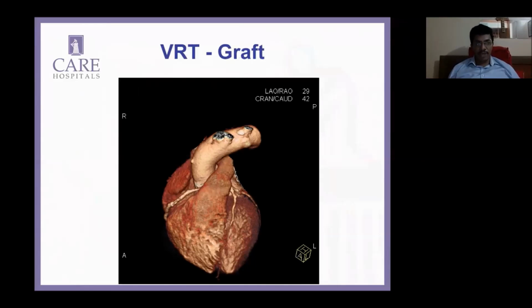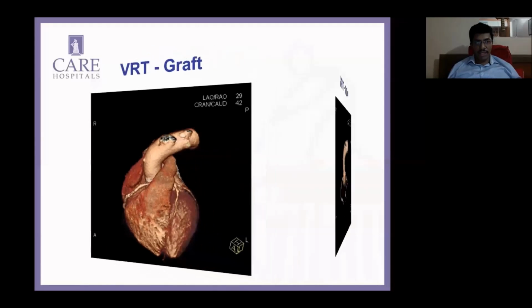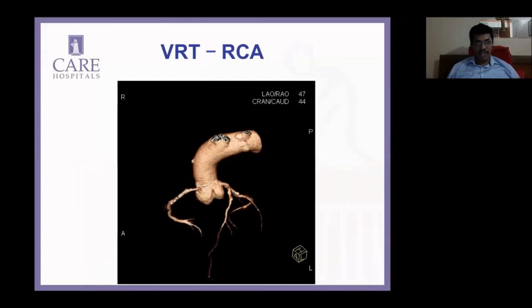So coming back to this patient, you can clearly see here that this is a nipple on this side of the aorta on the right side. That means there was a PDA or distal RCA graft. It's occluded, ostial occlusion. I don't find these things anywhere else. And I've had a look at the LIMA and RIMA. Both are ungrafted. They're not grafted. So that information I have. No other graft seen. These are all the great arteries that are coming off. I've just cut them to give you this view. And that's the only graft that I saw. That's a graft to PDA possibly.